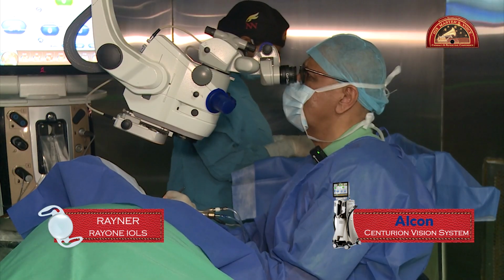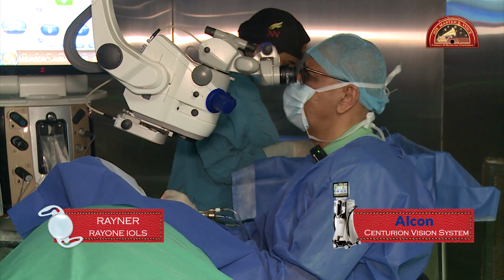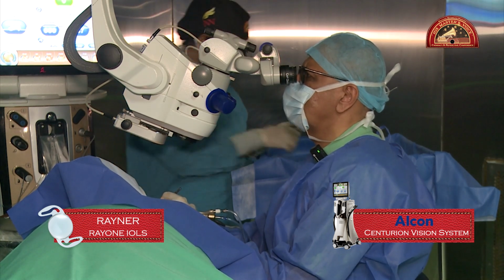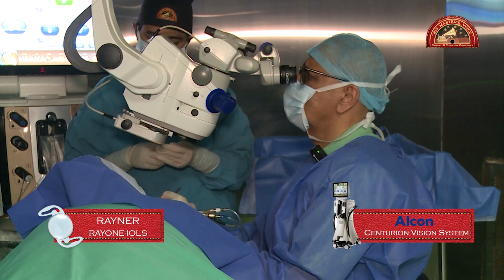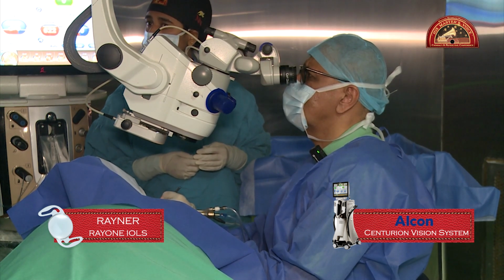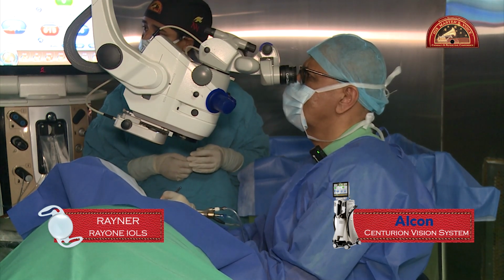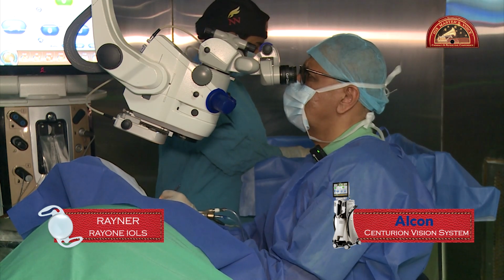Trying to chop it. So, grade 4 cataract, chamber very deep. Good, can you put some visco? Is it clear? Yes, Dr. Rohit, we are able to see. Very hard cataract. I'm taking my time.